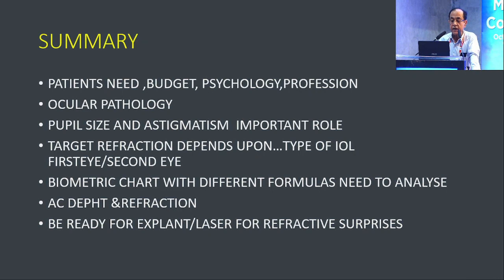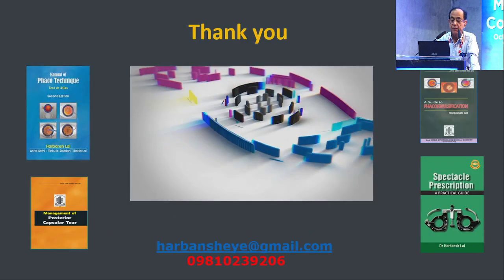role. Target refraction depends upon the patient's need, the type of IOL, and whether you are operating the first eye or the second eye. Biometric charts with different formulas need to be analyzed. Anterior chamber depth and refraction have to be taken into consideration. And all of us know how to explant the lenses if the patient feels unhappy. Thank you.